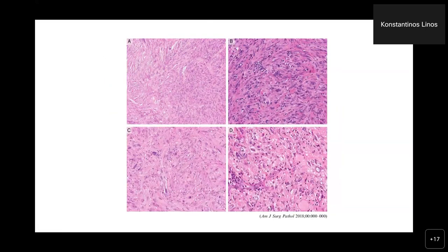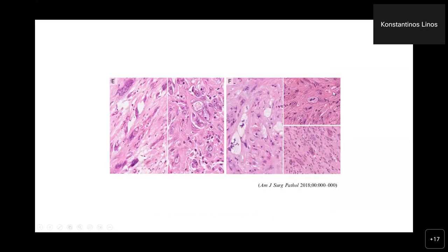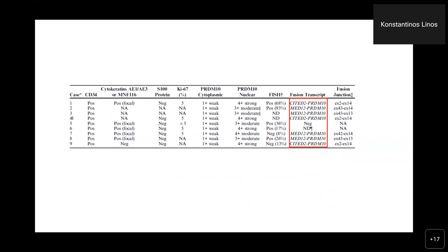And as you see here, even if you're not a pathologist, you can appreciate commonalities. You have this very pink, voluminous eosinophilic cytoplasm. The cells have large nucleoli, nucleomegaly, irregular nuclear contours, a vesicular nuclear pattern, moderately prominent nucleoli, and pseudonuclear inclusions. Some of them have mitotic figures, but most of them didn't have any increased mitotic figures at all. But the tumors, other than that, look very ugly, and they actually behaved very well. They didn't have an adverse outcome with good follow-up.